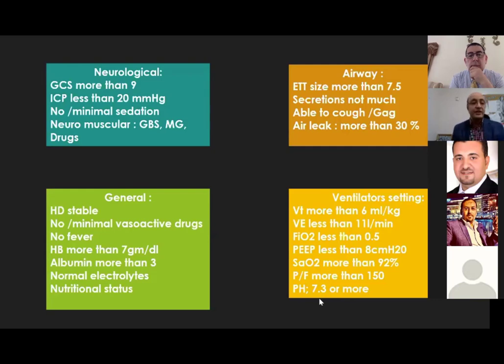I want to say that hemodynamics here is a package. It doesn't mean that you should rely on how much vasopressors you are using. If your patient, for the sake of positive pressure, is requiring a small dose of Levophed, but the other factors are fulfilled, you can try weaning. They shouldn't be, or at least preferably not be, febrile.